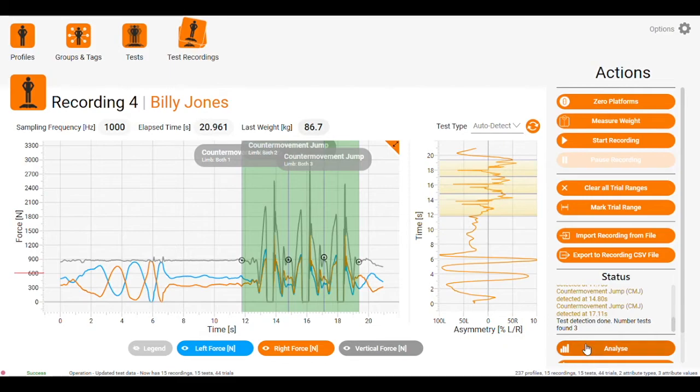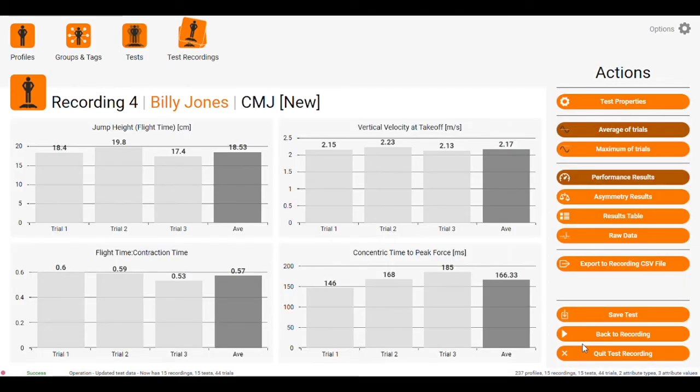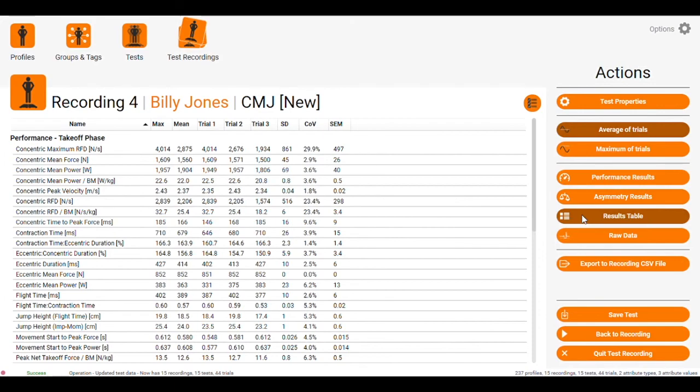Then we come across to analyze. We get our key metrics here. We get our asymmetry results by clicking the tab at the side. The results table gives us any metrics that are available across each trial. From there, we save test.